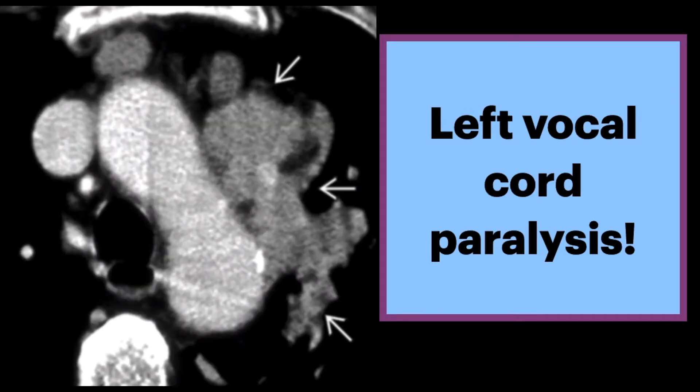In this same patient, axial CT at the level of the aortic arch shows a large mediastinal mass involving the left recurrent laryngeal nerve, as it courses under the aortic arch.